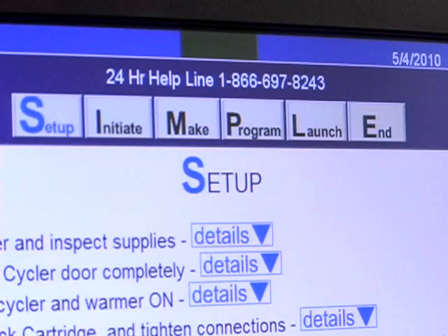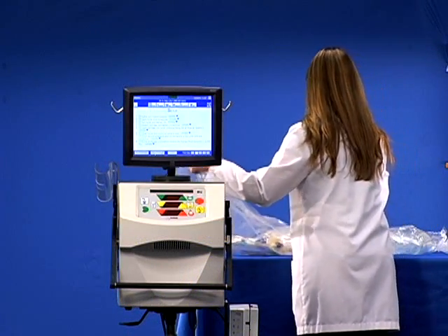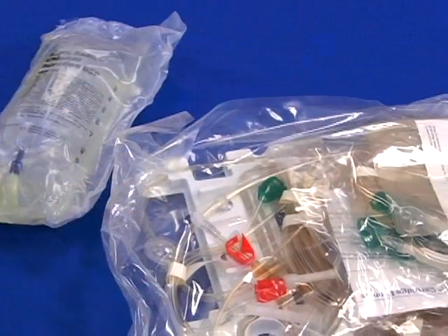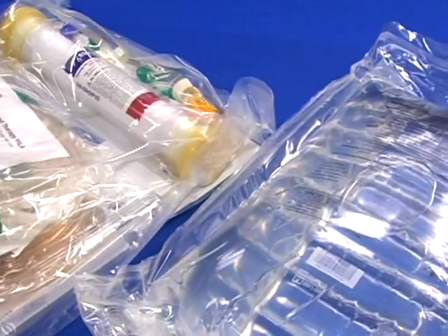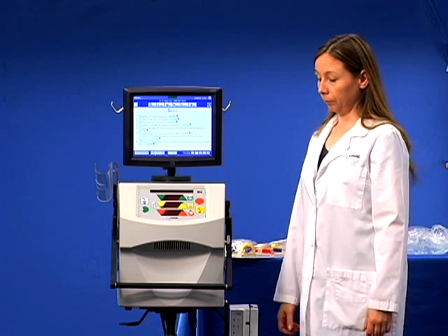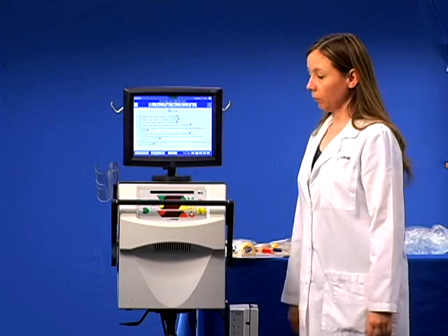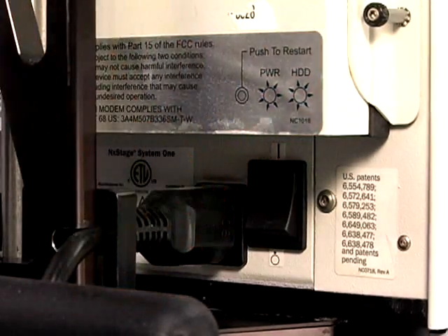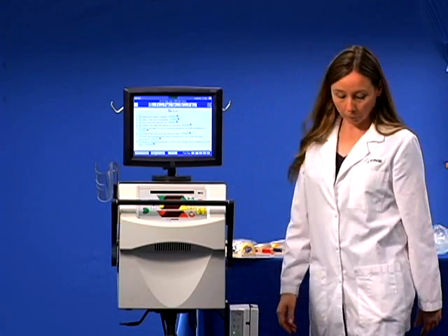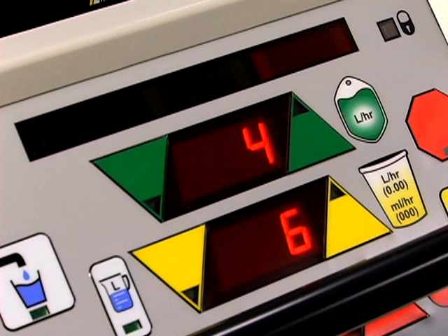We'll start with setup. Gather and inspect your supplies. Open the cycler door completely and leave the handle up. Turn the cycler and optional warmer on. Wait for the yellow bars to flash.